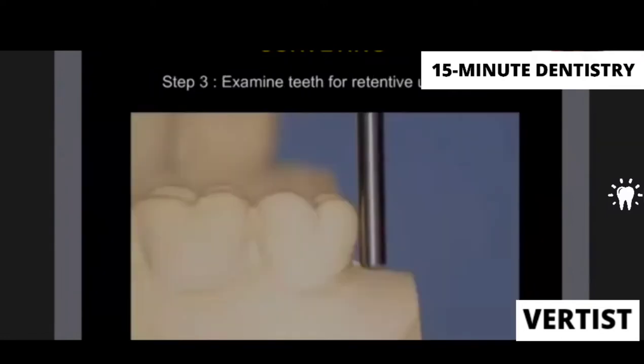Next, you're going to be checking for the retentive undercuts. Now, can you see this triangular area here? When you see this triangular area, what you draw is your undercut area here, just below your paralleling tooth. That's your triangle, and that's going to be showing what's your undercut that is present when you are applying your analyzing rod.